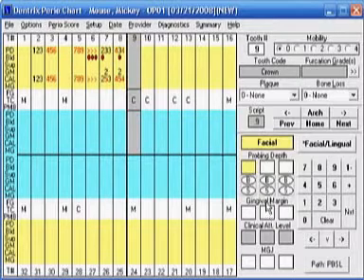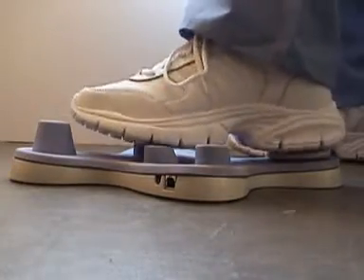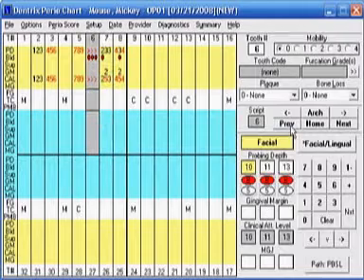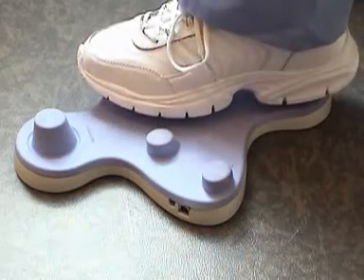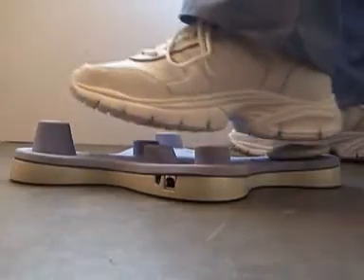Now if you make a mistake, the easiest way to go back is to go up to the previous button and go back to the tooth that you were on. Let's say tooth number six was a 3-4-3 — go back and press 3-4-3. And if you want to unmark the bleeding, just put your mouse on the bleeding icon and rock back with your heel.